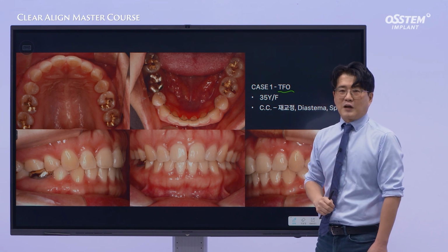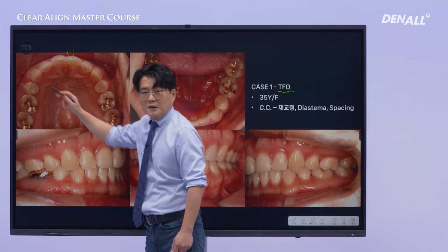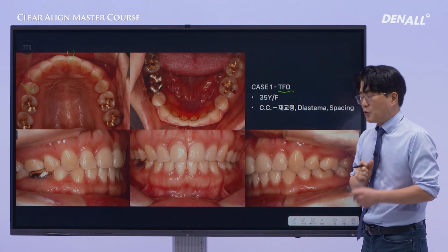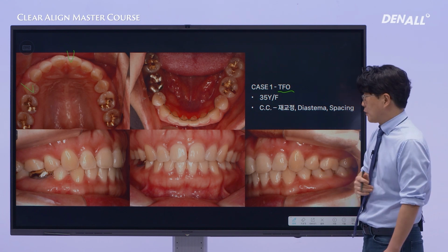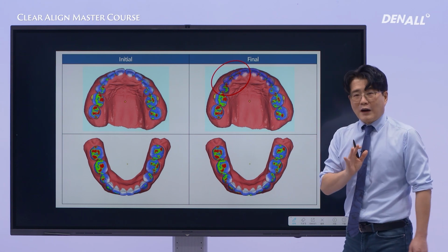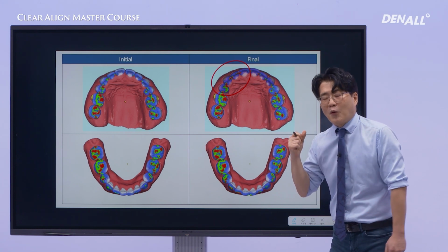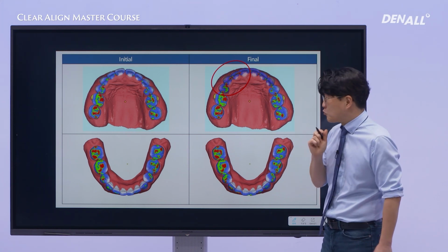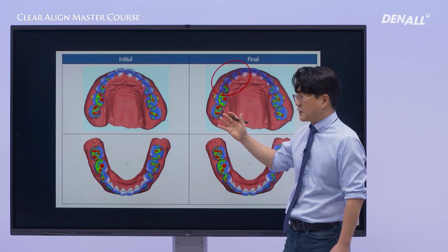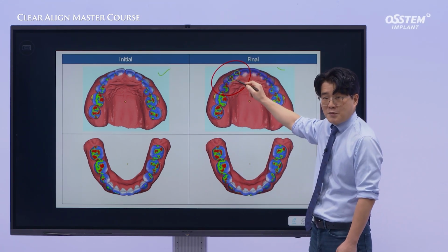After alignment and leveling, the central incisor, lateral incisor, and canine would be retracted together en masse. Even with such limited space, this process could take about 10 months. In this case, clear aligner treatment has the advantage of consolidating and moving the anterior teeth en masse in an efficient manner. In this case, the important point is to identify why the space has opened and whether it will reopen after treatment. On the web viewer, when comparing the initial and final setups, you may notice occlusal high spots.